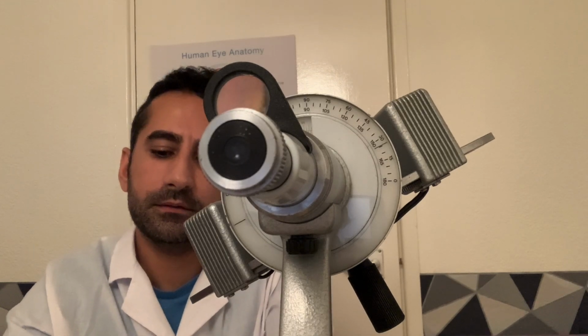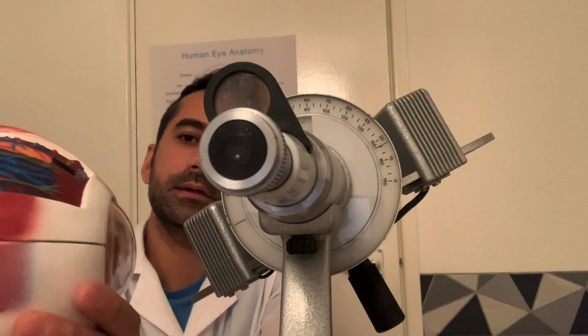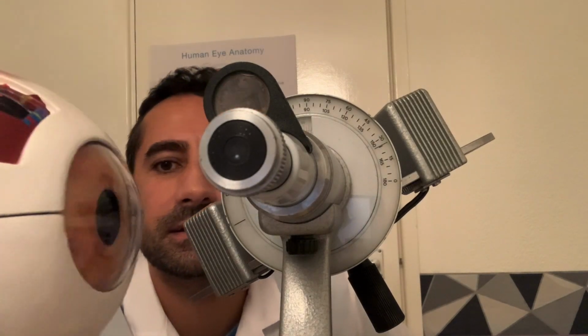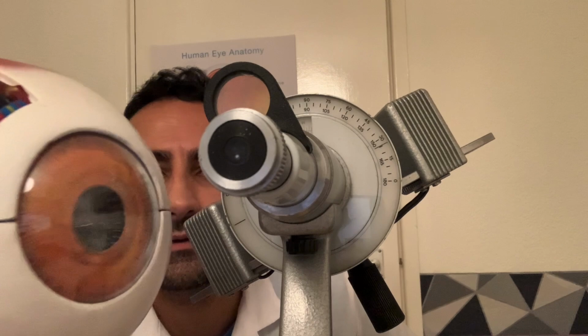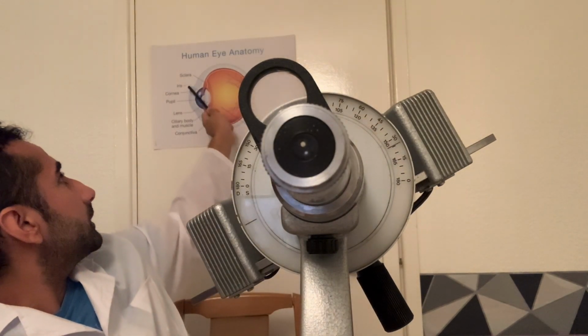So the cornea is the window of the eye there, and from the side the cornea is the transparent window to the eye. A very sophisticated optical refracting surface. This is the cornea, and the cornea is also located on the picture there.